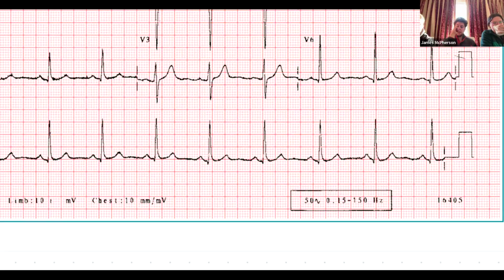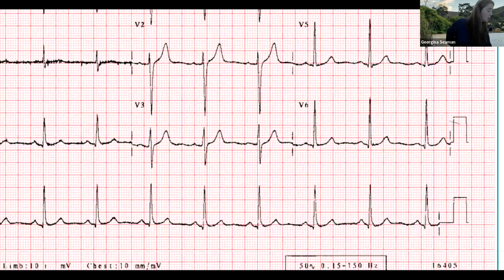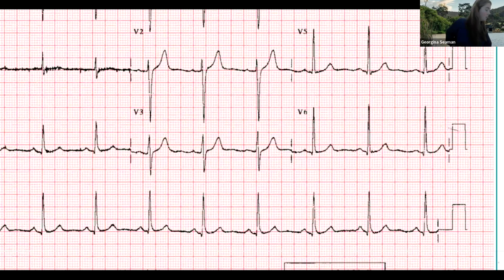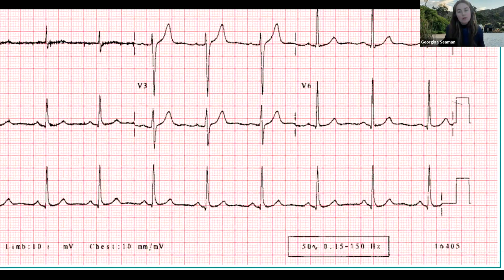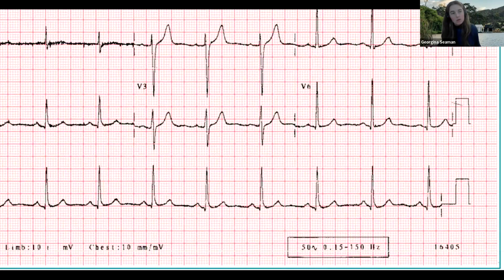Okay. Again, the machine will tell you. It's usually whether it goes to 150 or 40 or 60 as the upper. Again, it's dependent upon the machine, the setting there. But I will quadruple check that, but it should be 0.05. So yep, Milo might have a typo. It does say 0.5. All right, so we'll change. So Milo has 2 typos then, so it should be 0.05, and also the limb leads should all be not isoelectric.